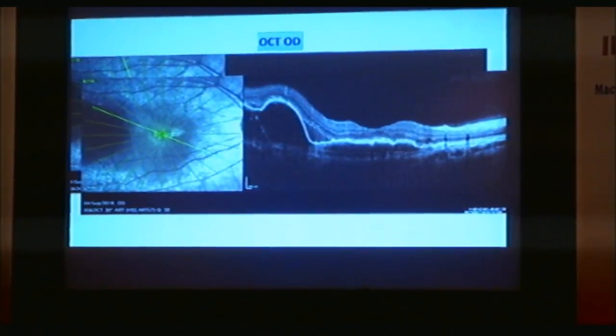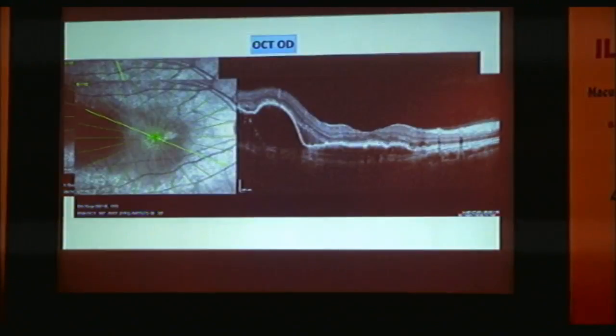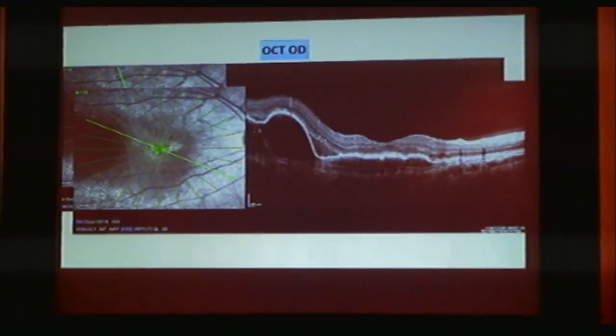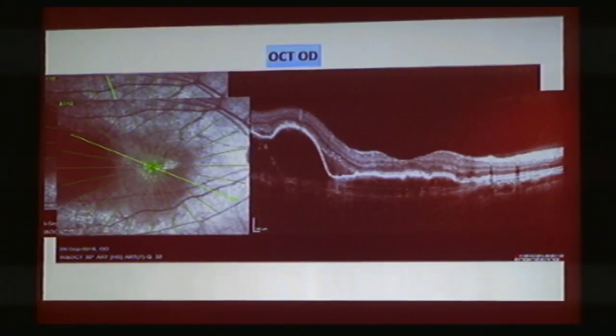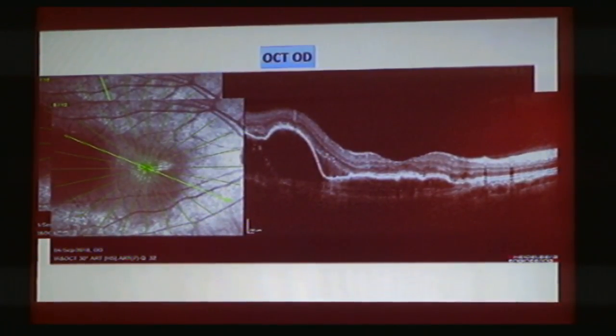You would see the whole depth of the choroid, but as soon as you start having features that may attenuate the light on top, the EDI will bring the sweet spot of the maximum resolution of the OCT to the under part of the retina. So you may see whether there's a true enlargement or increased thickness of the choroid.